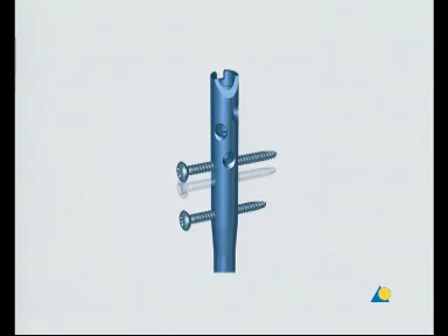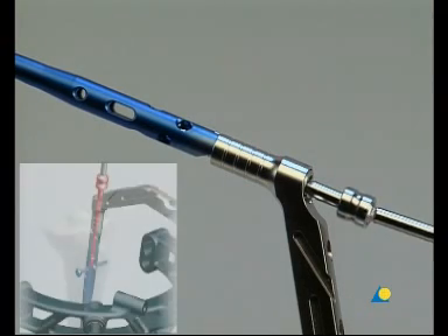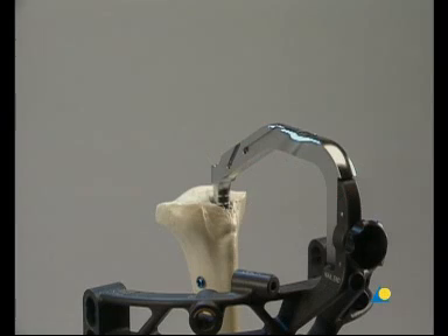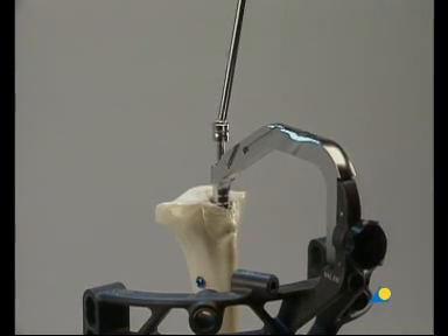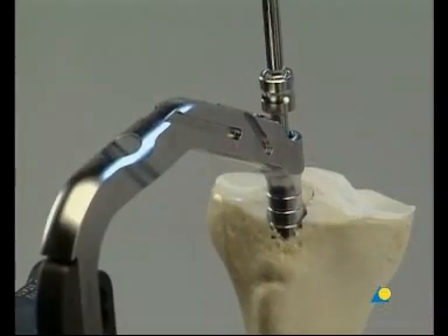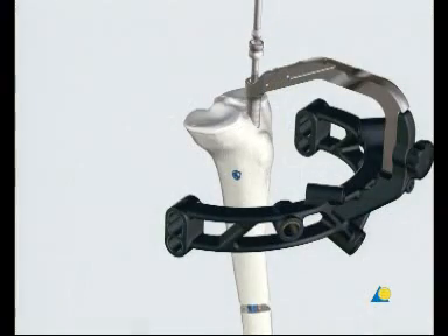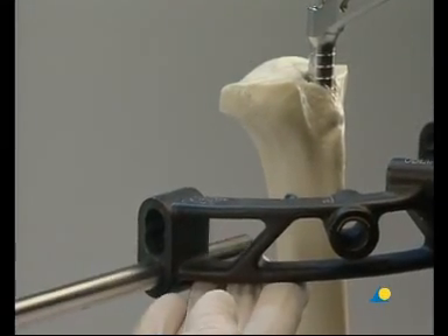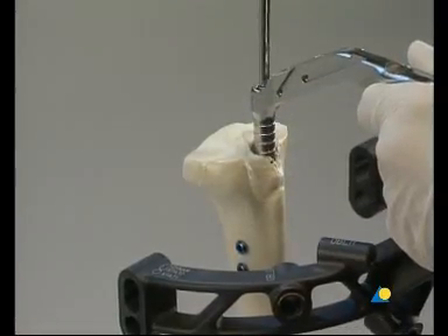Secondary dynamization is achieved by removing the locking screw from the static locking option. To enable primary compression, the compression screw is inserted into the connecting screw until the compression screw comes in contact with the locking screw. Each complete turn of the compression screw corresponds to compression of 1 mm. At this point of the procedure, the expert tibial nail has been locked distally, and one proximal locking screw has been introduced in the dynamic locking option marked DYNAM. This type of locking does not allow secondary dynamization. The fracture gap is continuously checked before, during, and after the compression procedure. The second proximal locking screw is introduced into the most distal hole of the proximal locking options marked STAT 1. The compression screw is then removed.